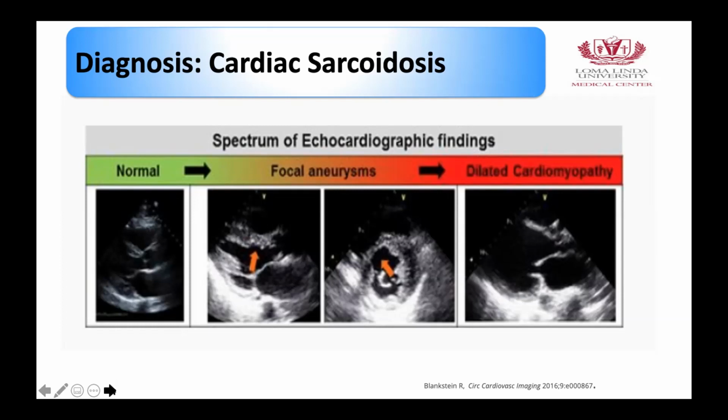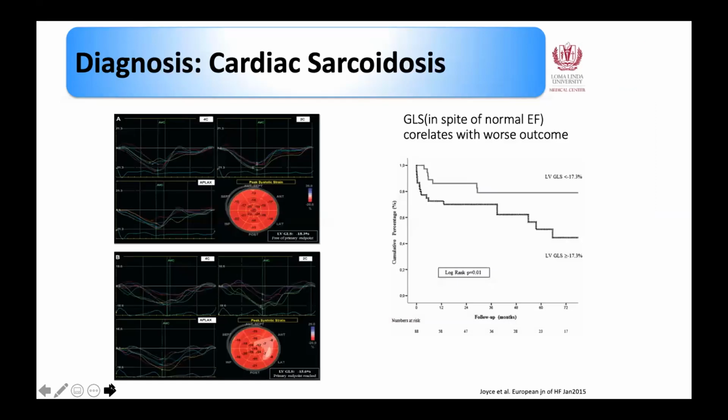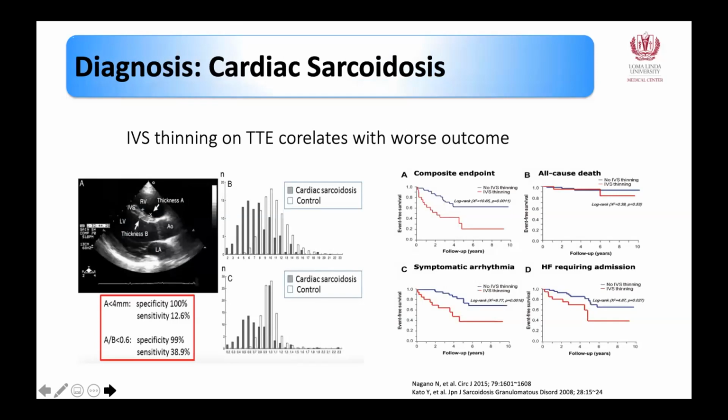And in fact, a lot of these patients remain undiagnosed. A lot of these patients are found when the heart transplant is done or the autopsy is done. So there's data about GLS correlating with worse outcomes in these patients. So strain is important in any of the cardiomyopathies we talk about today, and we are going to speak more about strain in amyloidosis. So just keep this in mind. And then the thinning of the interventricular septum on transthoracic echo also has been associated with worse outcomes. So keep that in mind.